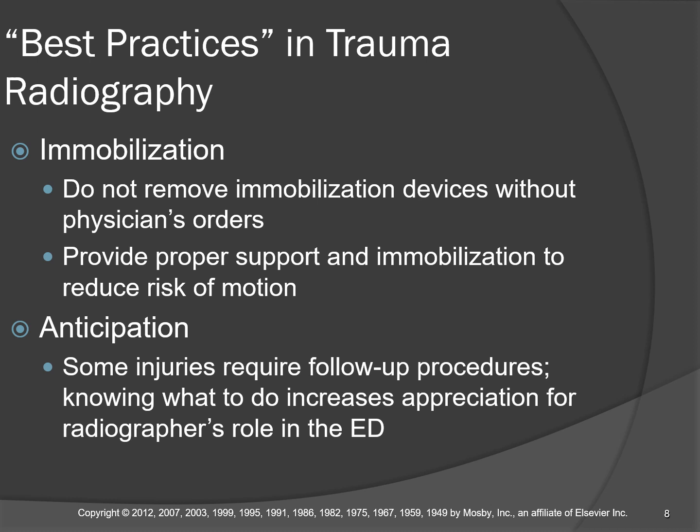Are you done? Can you just send the picture you took and leave the room? Are you done? The answer is no, you're not done. Unless your next x-ray is right next door, I wouldn't leave. I would stay, because if the nurse is fetching the thoracostomy tube, that physician is about to insert a chest tube right there at the bedside.